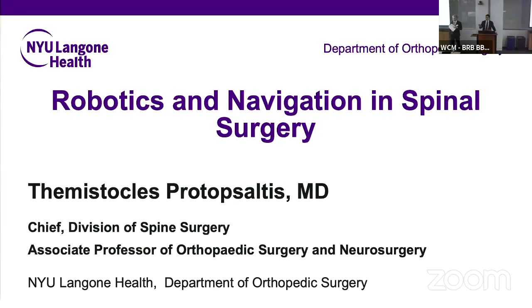Hi, Jason Perrin from Mannheim again. You asked if there are any tips, like if you're unsure about the accuracy, and especially when you said the learning curve is best to start with open, simple cases. What you can do is put in little screws as bone fiducials, which you can always re-reference and check the accuracy. It is also a very good procedure for open cases.